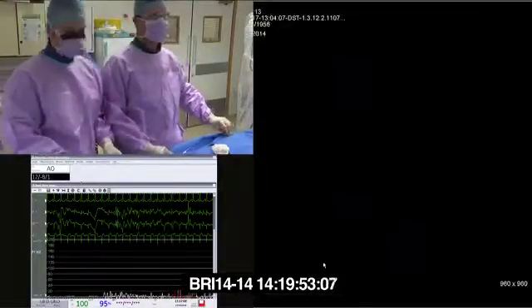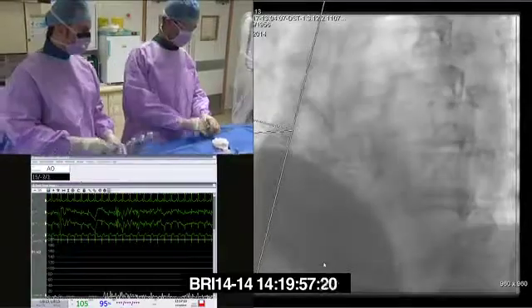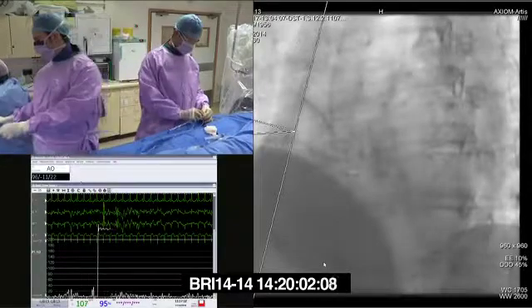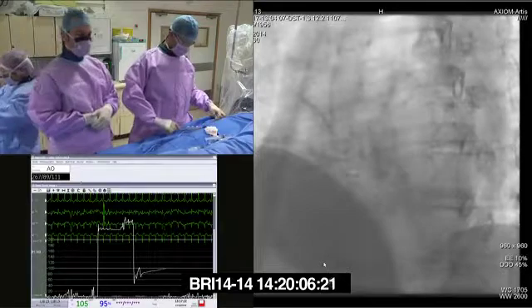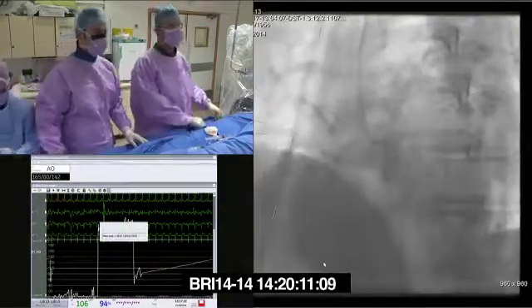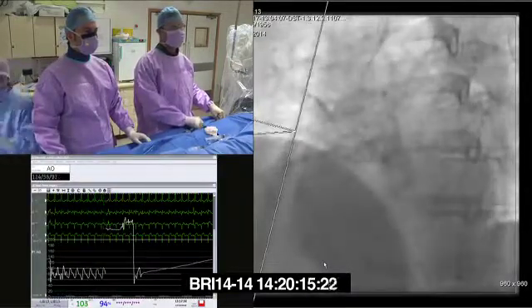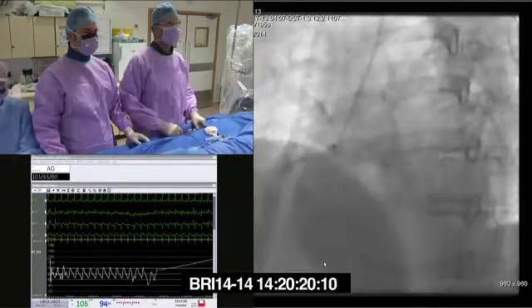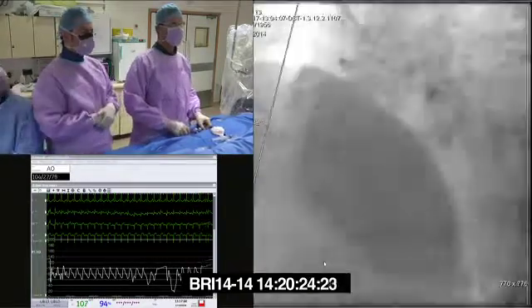Okay, let's just come LAO, please. That's yours. Thank you. I'd leave them on. That's fine. Thank you. Flushing. Okay, so right 4 diagnostic, 5 French. And quite a marked tachycardia, which would fit with where we are. Okay, and mag there.